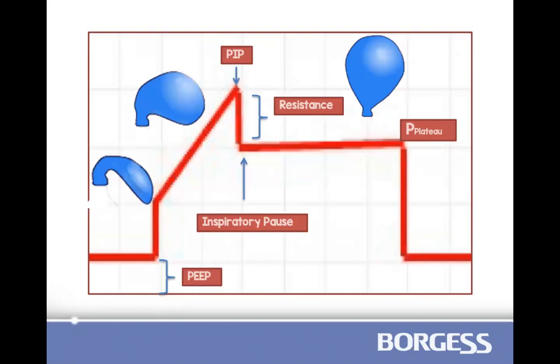Here's a little graph talking about the pressures, and those are balloons, by the way. When you have a balloon that's poorly inflated, then you inhale and you get to your maximum inspiratory pressure. And then you want to keep that open, because that is where your oxygen exchange is happening. Now, the difference between your peak inspiratory pressure and your plateau is actually called your resistance.